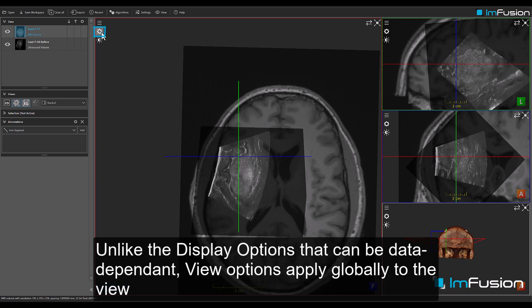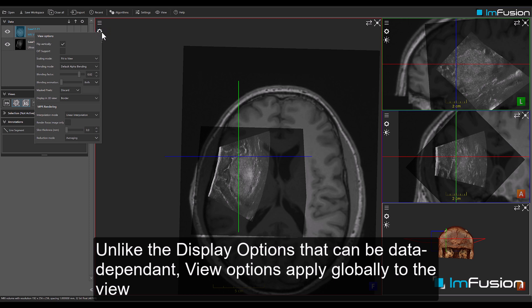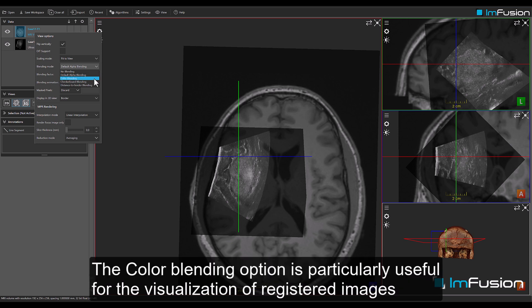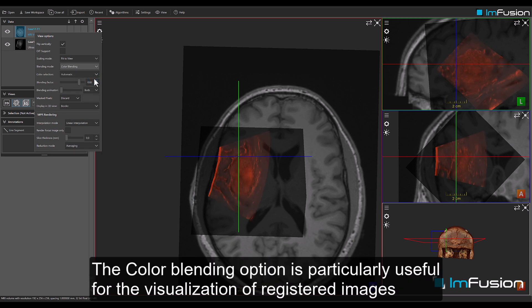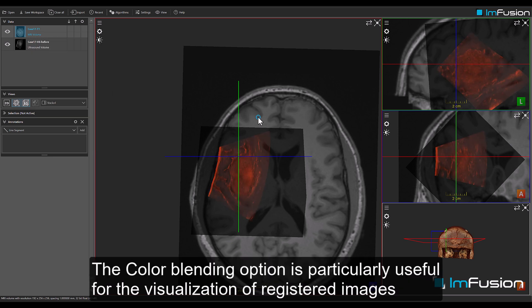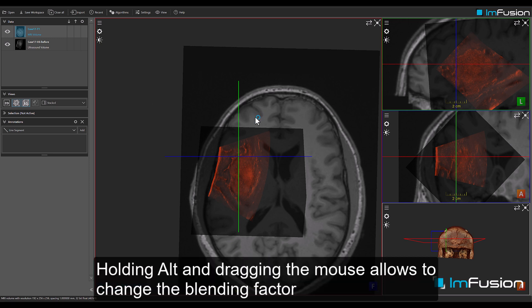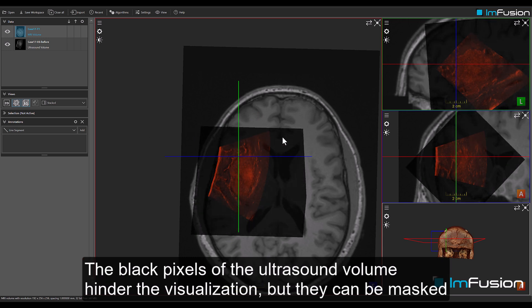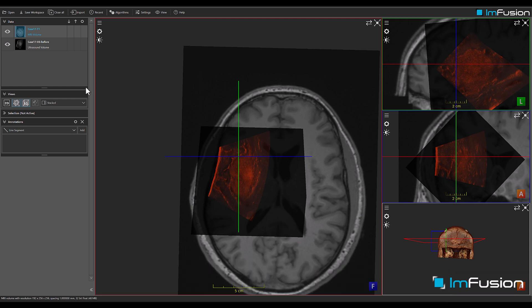Unlike display options that can be data-dependent, view options apply globally to the view. There are many blending modes available. The colour blending option is particularly useful for the visualisation of registered images. Holding Alt and dragging the mouse allows you to change the blending factor. The black pixels of the ultrasound volume hinder the visualisation, but they can be masked.